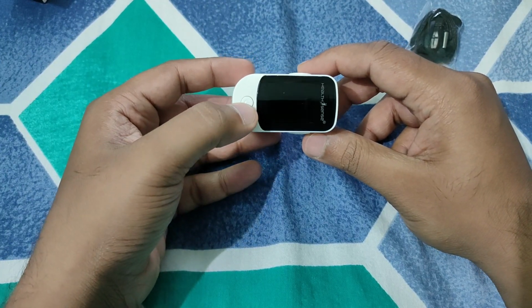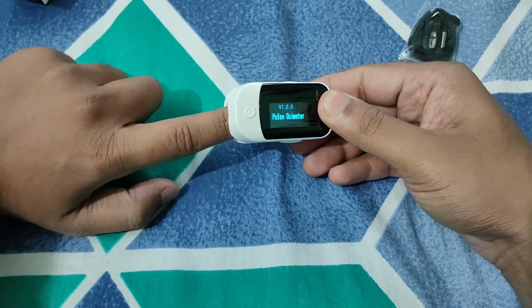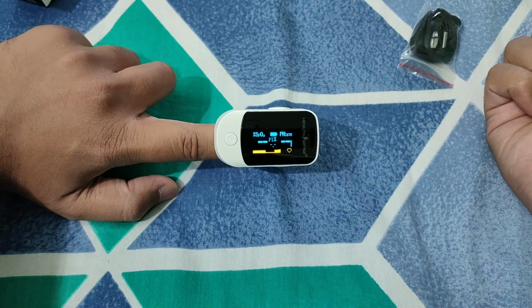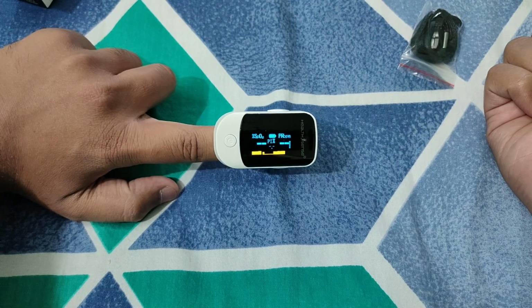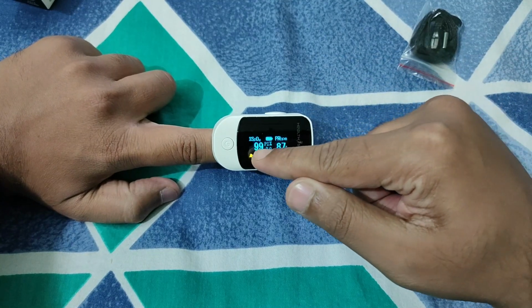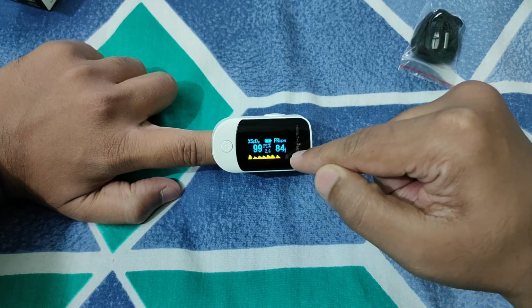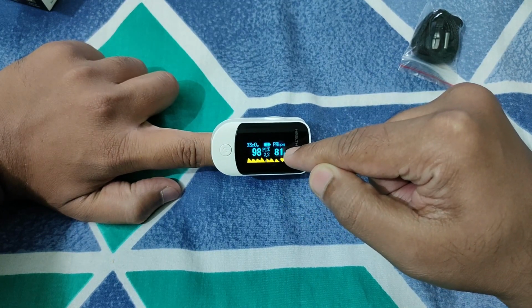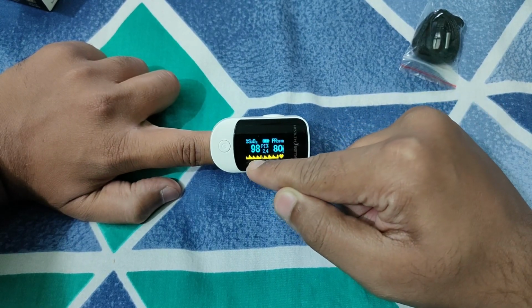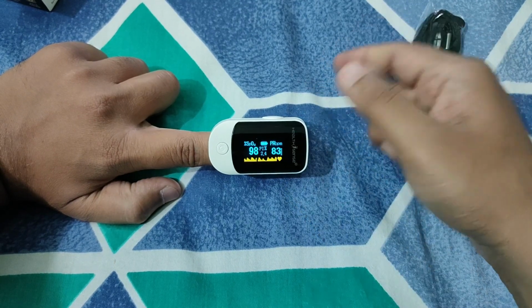So we need to switch it on again by pressing this button. Let's put my finger inside and measure the vitals. It is measuring. You can use this on any finger. There's a beep coming. You can see this is the SpO2 level, which is 99%. This is my beats per minute, which is 84, and it is in real time. It's dynamic, so it is changing. There is the plethysmograph, and this is the perfusion index, which is 2.4.